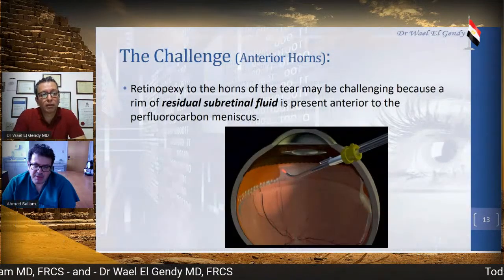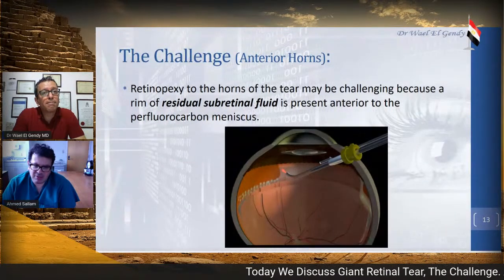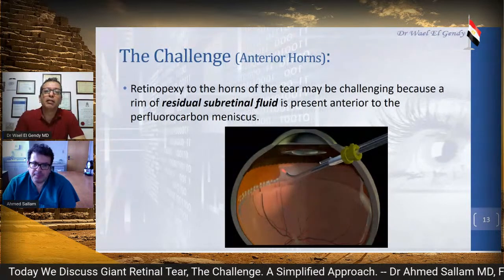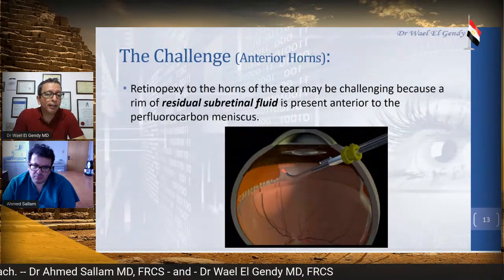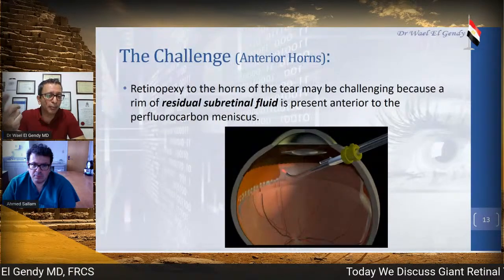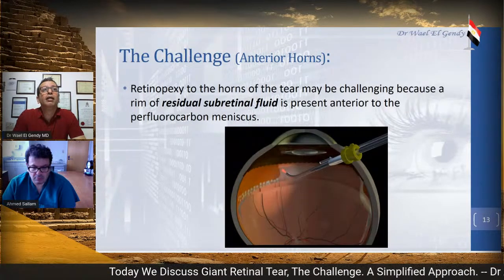I try to keep retinal detachment very simple, and I don't remove the lens unless it's interfering with the view. Okay. All right. And if you have a problem with the laser, the peripheral laser or anything, you go on gas, and we have the curved laser probes that can prevent any lens damage.